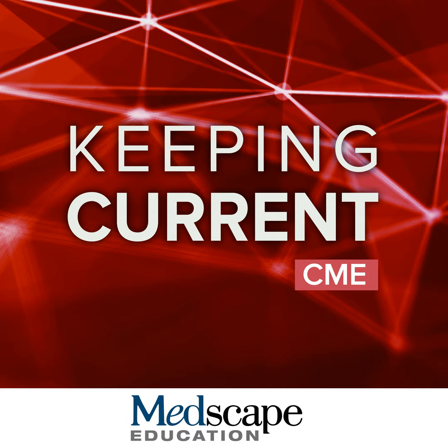DTI is used clinically. We use it, for instance, for brain tumor patients. Because when the surgeons plan their surgery, they use the DTI and the tractography information to try to plan their approach. So that's one example of clinical use. It comes with a lot of caveats, and typically it's just the first indication for the surgeon when they decide their approach, but they are not going to trust the DTI completely.